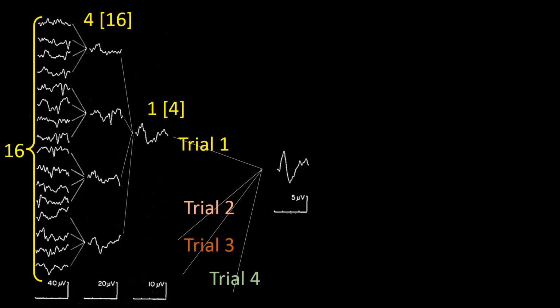As you can see, now that we add these 4 potentials, the result will also be in amplification. In this frame, the vertical line in the last potential is 5 microvolts. The potential, as you have seen, has become larger, and therefore the legend indicating the vertical line has gone to 5, as we just have mentioned.